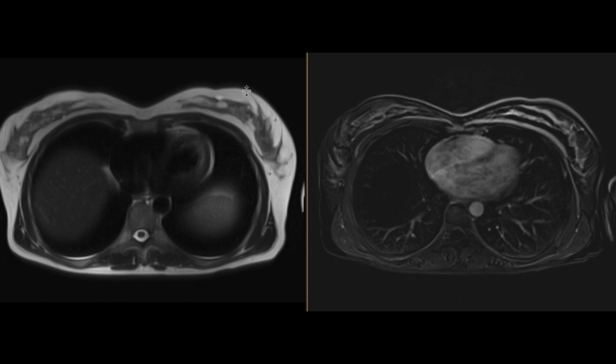This is a patient in her 50s who comes in with abdominal pain. There was a CT scan, and an ultrasound showed a mass in the left hepatic lobe, and an MRI was performed to further characterize it.